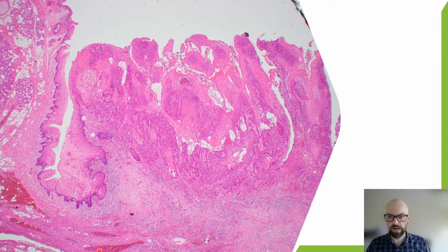It's also quite hard to imagine where the basement membrane would actually lie. Possibly it's around this region, but it's really hard to tell. So some of those papers which I showed previously recommend just taking tumour thickness in these instances.